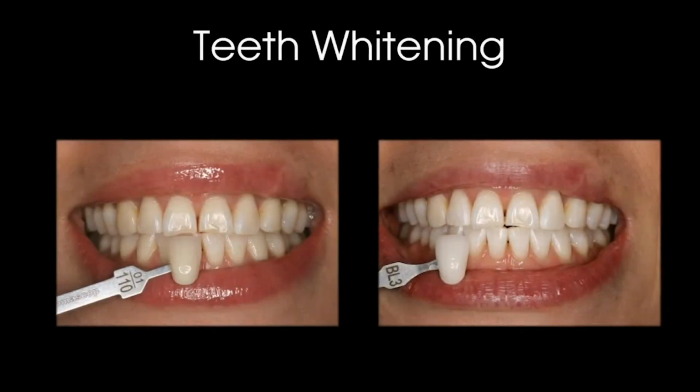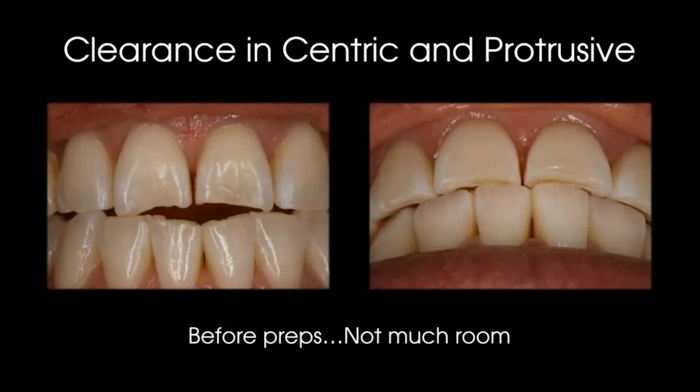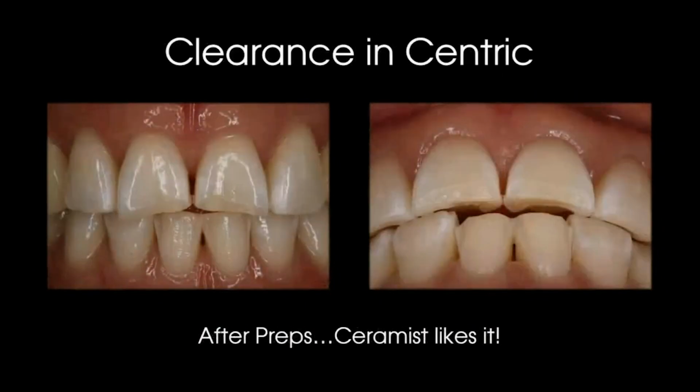And so here we are. We picked out the color. She did some tooth whitening to take her a shade or two brighter. And the clearance, in centric and protrusive before preps, not much room. After preps, and the ceramist likes it a little bit more. The lower we had to prep because she's biting on it. So incisally we prepped it. Alternatively, you could try and intrude those teeth and create some room too. But we did a little bit of the prep of the lower incisors.